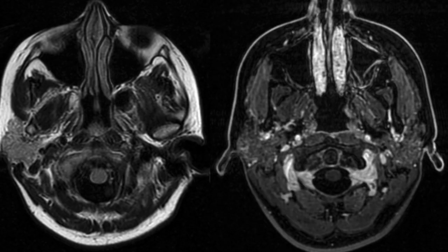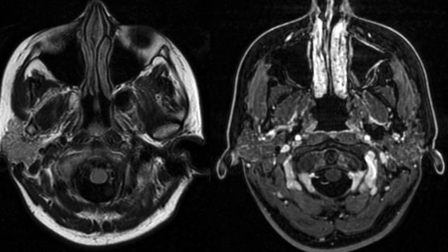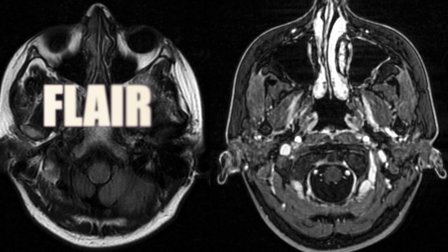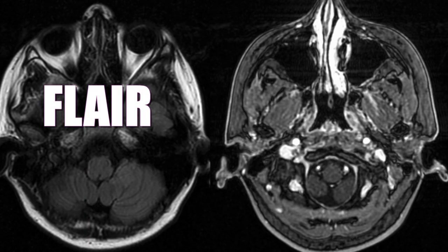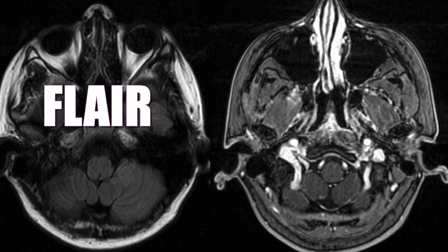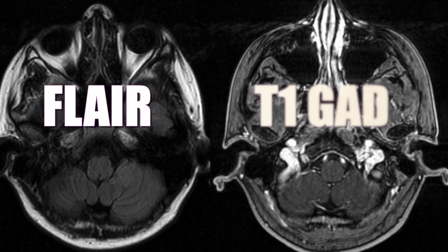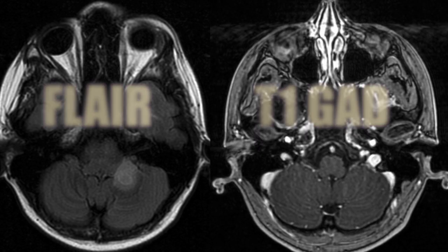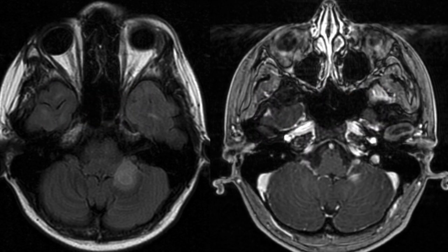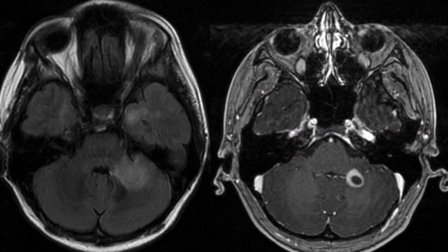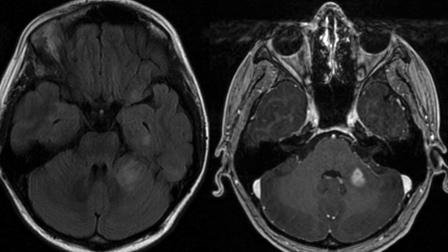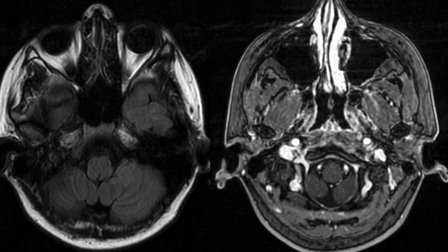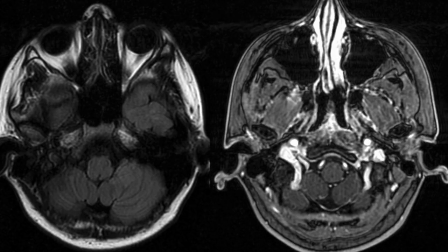Here you see two different sequences of the same brain. On the left hand side is a water-based image called a FLAIR-weighted image, and on the right hand side is after the administration of the contrast dye. In both cases the person is laying flat on their back looking up at the ceiling. You see the nose at the top of the page.